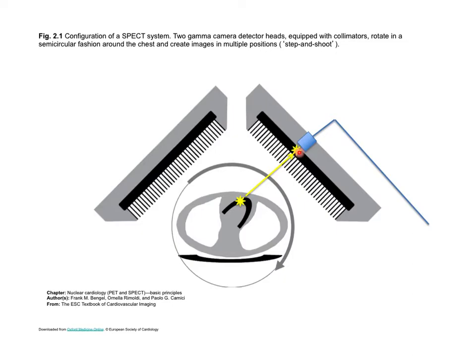So when you're looking straight down and you have these septa that are limiting your field of view to straight down, obviously the deeper you go, the farther away you go, the larger the object is that can get inside this gap between the septa, right? So as I go farther and farther down, I get a bigger field of view that can get photons into that location, right? Until finally, like when I'm 1,000 light years this way, a galaxy can get a photon into there. A galaxy's a big object, right? But that's how it goes.